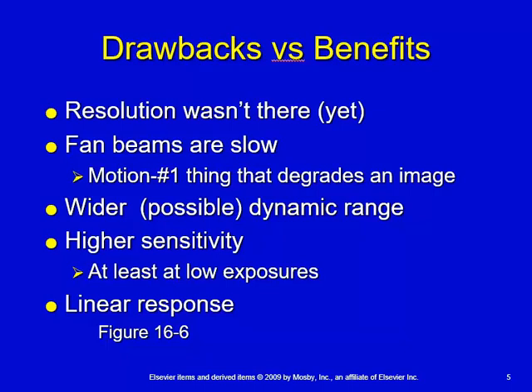The low exposures on CR and DR, even all the way back to where we were using scan projection radiography, could have been more sensitive. At the upper end of the exposure, what you see is film becomes more sensitive than the digital processing.